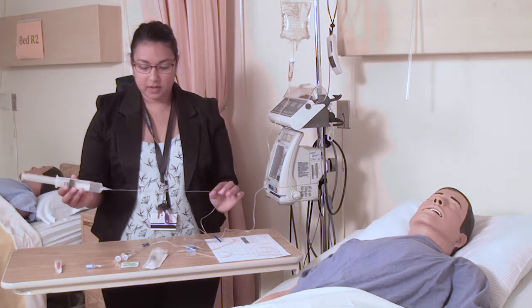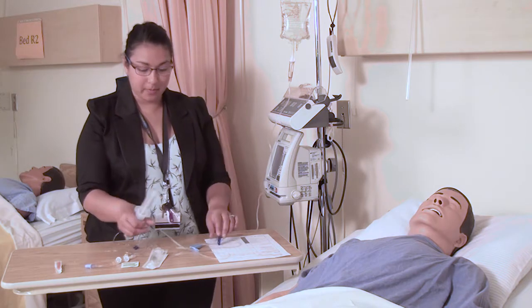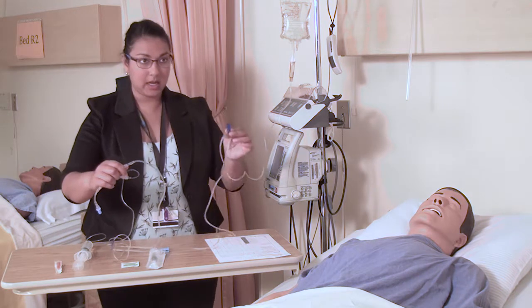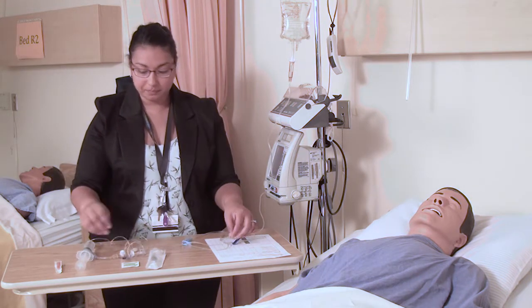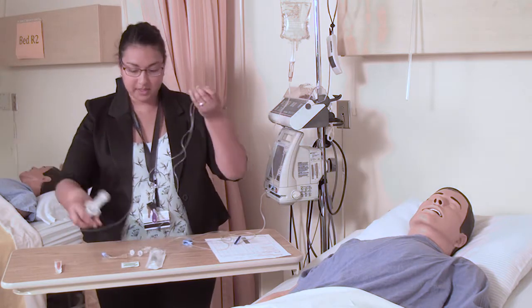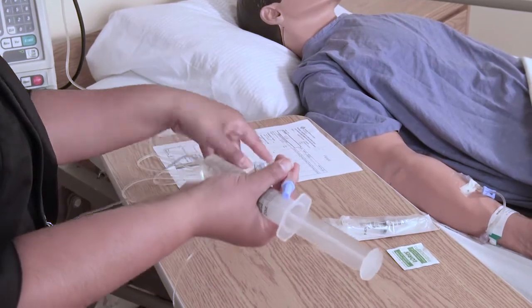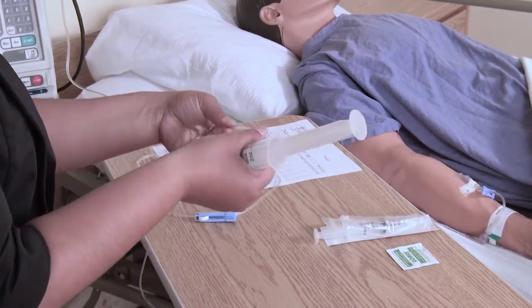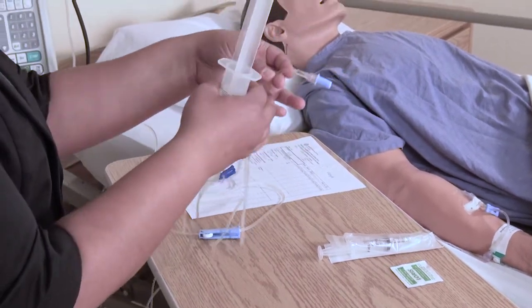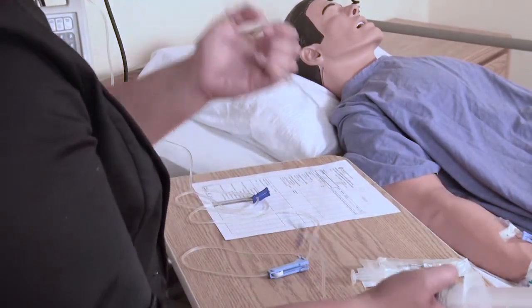So now that I've primed my PCA tubing and my carrier tubing, remember this tubing has no ports on it, so nobody can inject any medication. And my PCA tubing is primed. See how it's on the Y connector? The carrier is in one and the PCA is in one, and it's primed all the way to the top. This is the part that's going to connect to the patient. But you don't connect it to the patient until you finish doing your two-nurse check with your PCA pump.